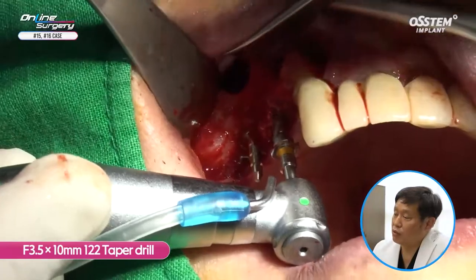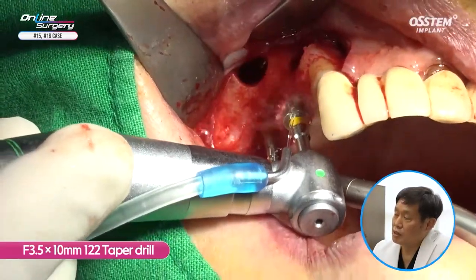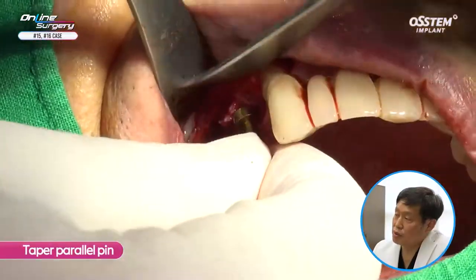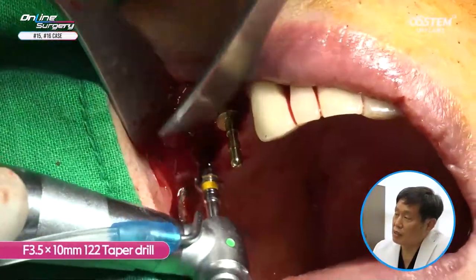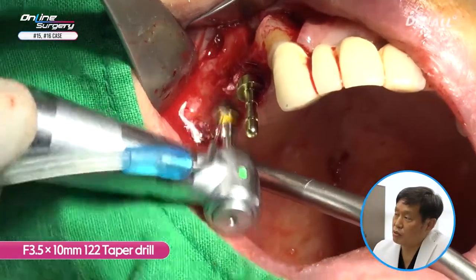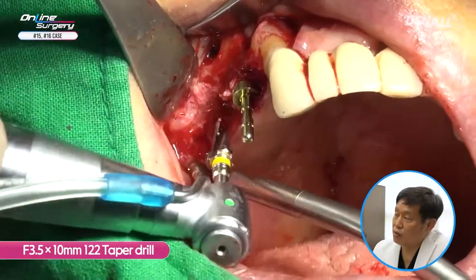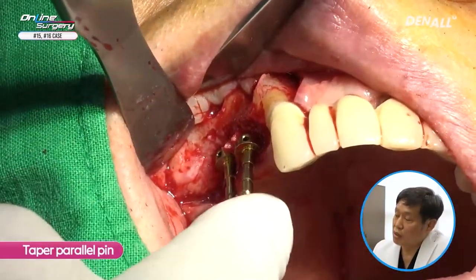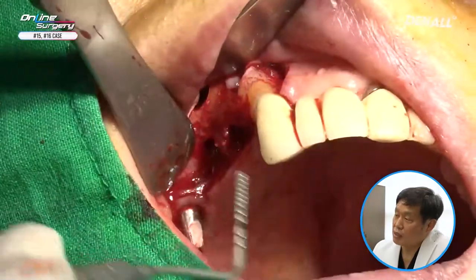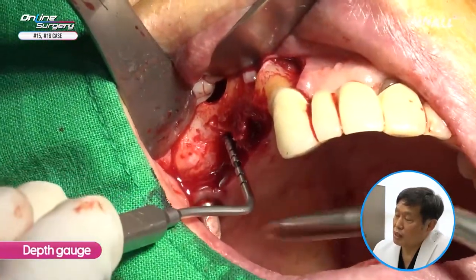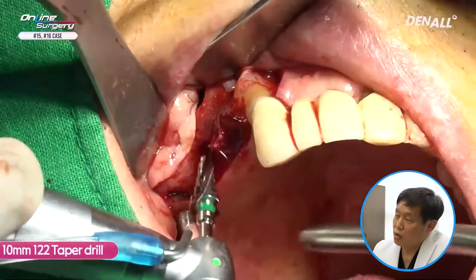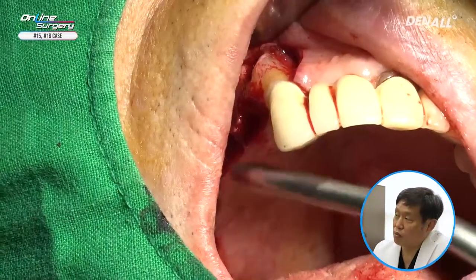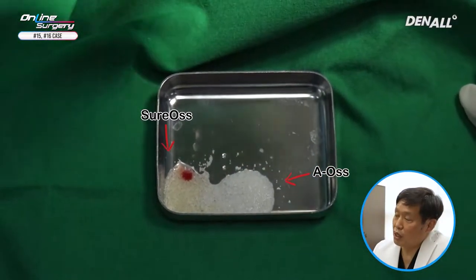A 3.5 by 10mm 1-2-2 taper drill is used. After the taper drill, a 3.5 by 10mm taper drill is used again. A taper parallel pin is used to check the relation with the antagonist. A depth gauge is used to check the residual bone height. On the distal side, a 4.0 by 10mm 1-2-2 taper drill is used. I'm not drilling full length.